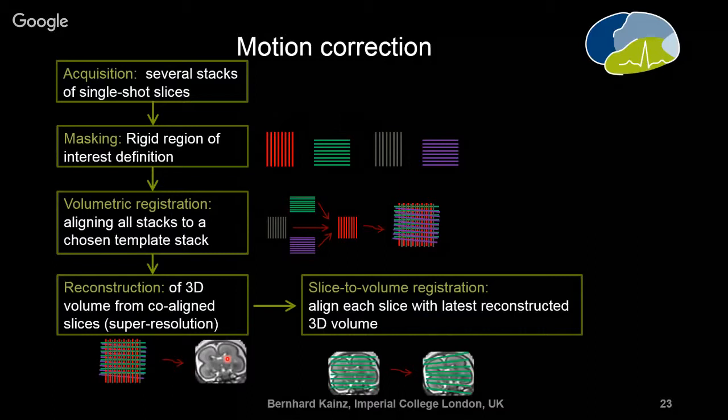So what we do at this stage, we break the parallel alignment of the slices within the stacks, and we realign each of the slices individually to fit this initial guess of our volume a little bit better. We are not aiming for perfectionism at these stages. We just try to make it a little bit better to model the motion here. Slice to volume registration is basically quite simple. It's an intensity-based approach. You can implement it however you like. Usually we use something like a gradient-based cross-correlation approach, but this is just a detail.